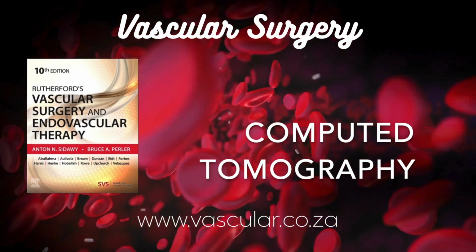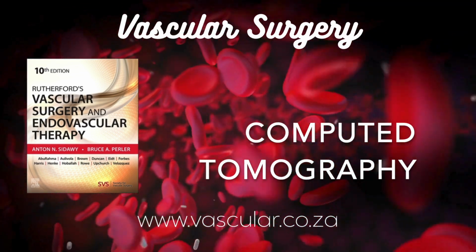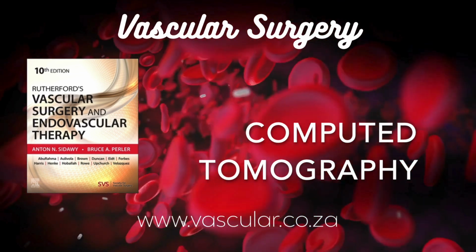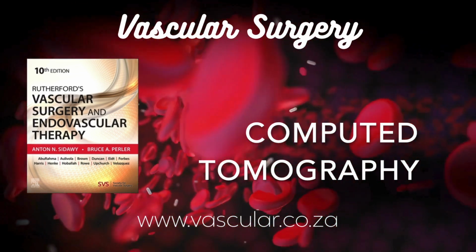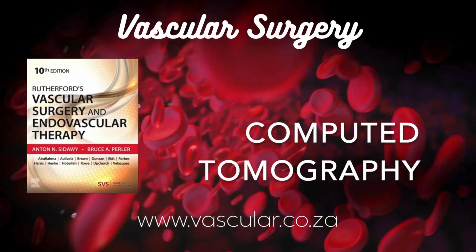Scanner problems. Yeah. Windowing errors. Yep, equipment can malfunction, calibration can be off causing rings, and just setting the window width and level incorrectly can hide pathology. Too narrow a window hides density differences. Too wide washes out subtle contrast. Interpretation takes practice and awareness of these things.